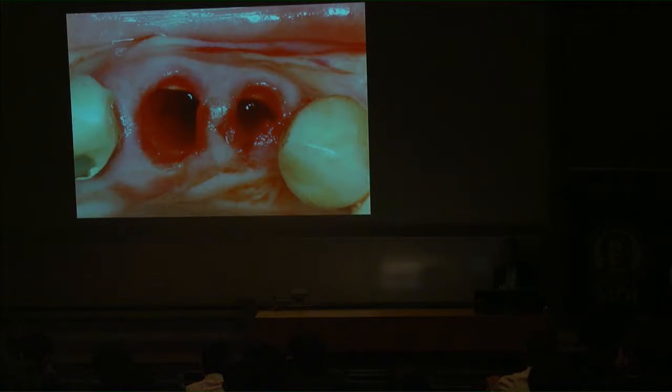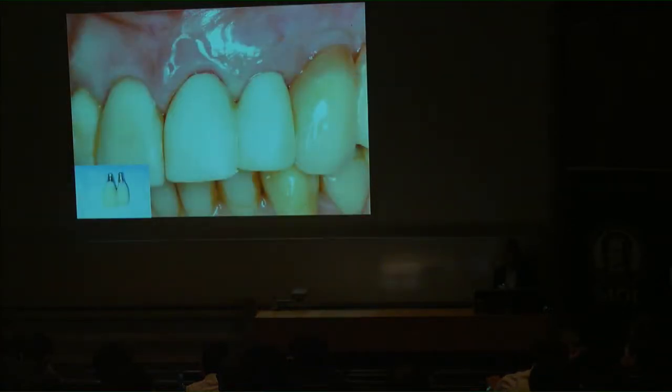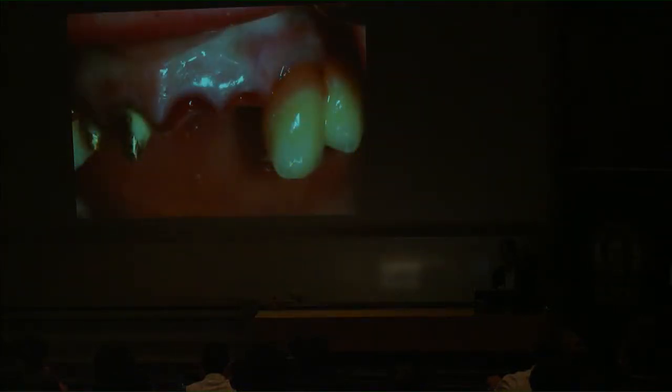The shield just before the final preparation. Post-op photo and immediate temporization. Gingival wound condition at the time of final impression, usually 4 months. The intact papilla demonstrates that the buccal bone preservation seems to also have the ability to preserve the inter-implant soft tissue.